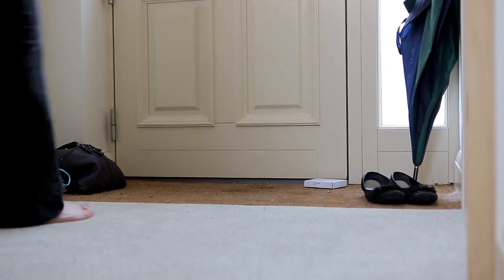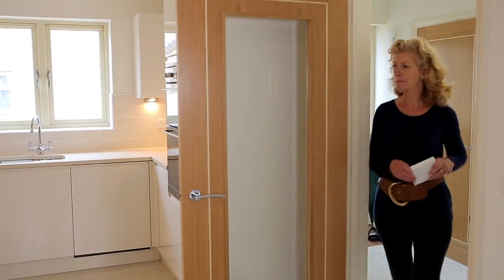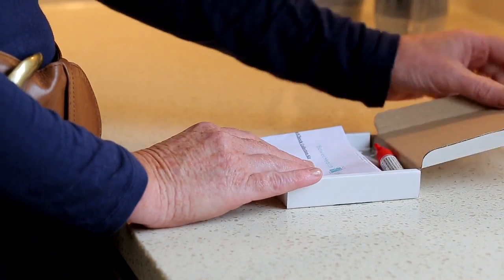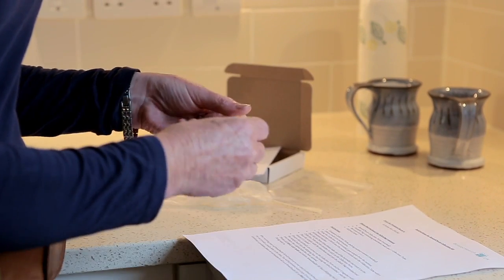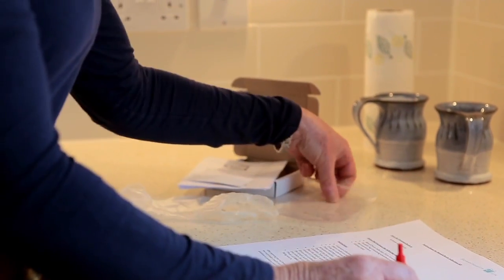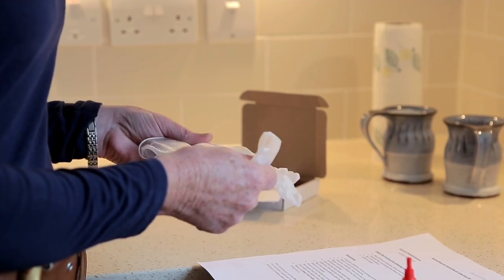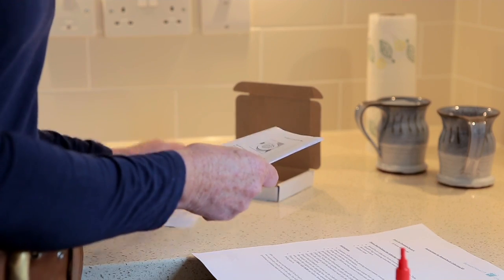Once you have signed up to BowelCheck you will receive the testing kit through the post directly to your home. The kit looks similar to this. When it arrives simply open the packaging and in it you will find a set of simple instructions for use, a small plastic tube with a label attached, a small plastic bag, a glove in case you choose to use it, paper stool catchers and a free post returns label.